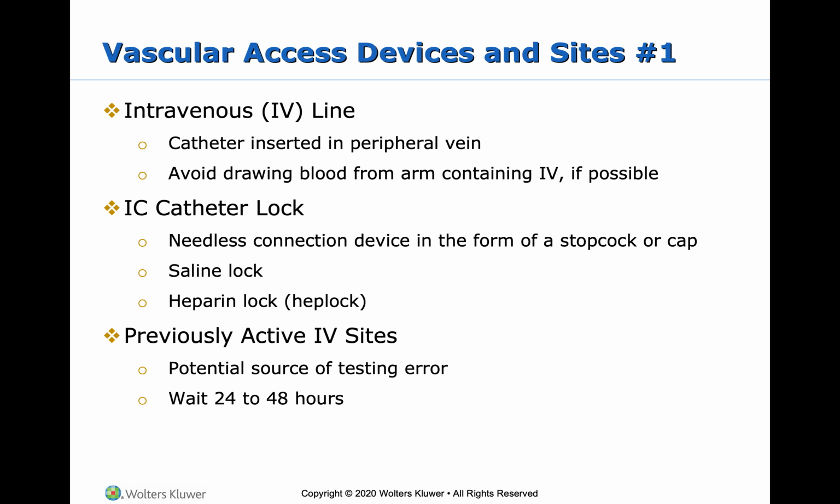Ask the nurse to restart the IV after the specimen has been collected. So make sure that you are letting the nurse know after you collect the specimen, because they're going to be kind of pissy if you don't. They are waiting to start the IV for you to finish, and you just never go and let them know. So keep the nurse in the loop, because their IV flow rates must be precise, and starting or adjusting them is not part of a phlebotomist's scope of practice.